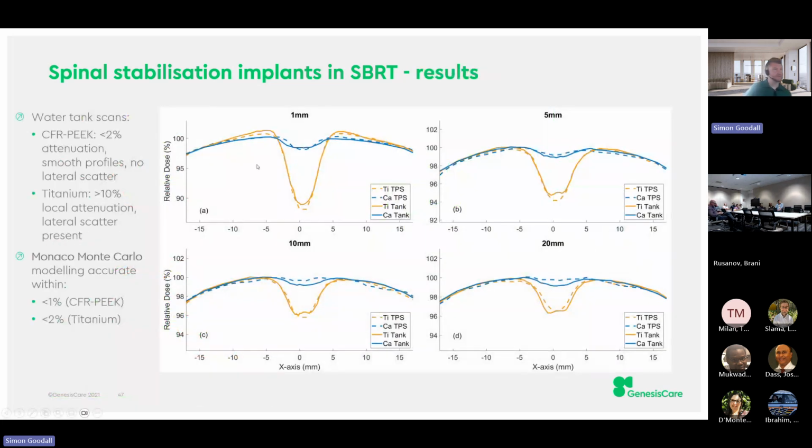So the results were probably as expected. The titanium has a really quite severe impact on the dose distribution or on the beam profile and fluence. It can cause up to 10 to 12% attenuation within the immediate proximity, and that reduces down to probably only 4 or 5% once you're 2 centimeters away. And we also see this increased scattering very close to the screw in the lateral directions as well, which we know is from the increased scatter from the titanium.